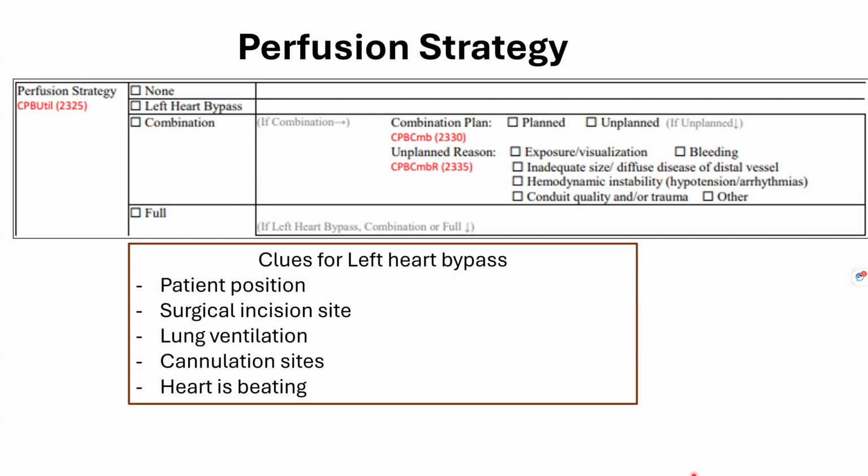What's the advantage of doing left heart bypass? The ischemic time is not going to be for your heart. When we talk about ischemic time, it will be peripheral, organ ischemic time. It won't be your cardiac ischemic time. Right, right. But what's the advantage?